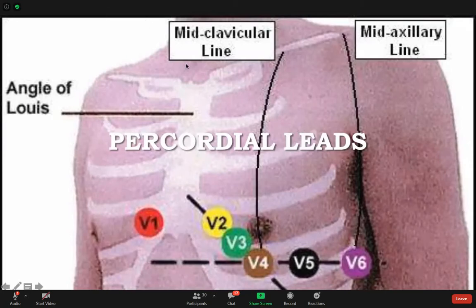Doctor, it's gonna be 10 leads, 6 in the chest wall, and the 4, 1 in the right and the left arms and left legs and right legs. That's it. Exactly. So it's 10 electrodes. So 10 electrodes, you're gonna attach them أول واحدة هنا. Usually they attach it here. Yep. And the end of the foot, just before, above the ankle, just above the medial malleolus, you're gonna attach one on the right foot and the left foot.